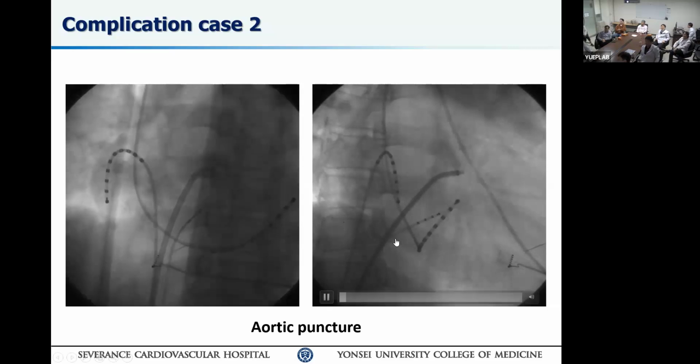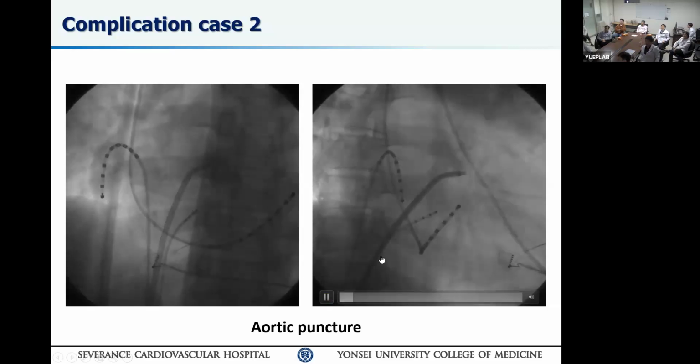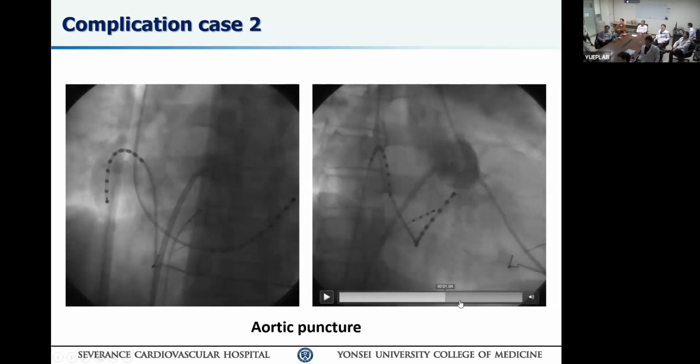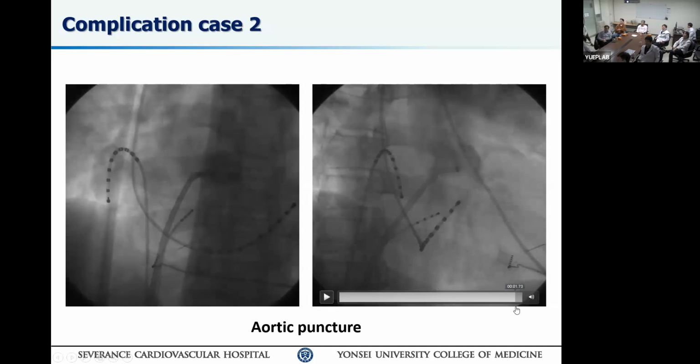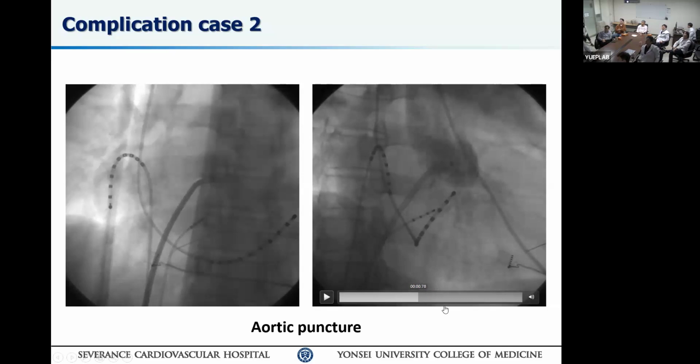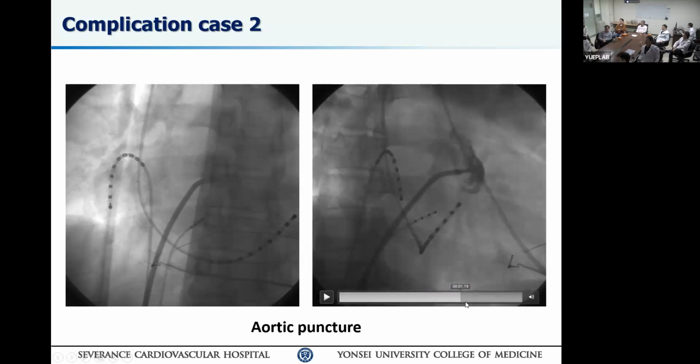The right side picture. Yes. Always look at the best view. What do you see? Dye leaking back to where? You said you did not know where the puncture was. Where do you think it is leaking backward around the sheath? Look carefully. There's something coming out. Yeah, right there. So it is important to know whether the dye contrast is coming back to you or not. If it's coming back, you need a surgery. Okay, don't play with that. That's the one tip that we always watch for.